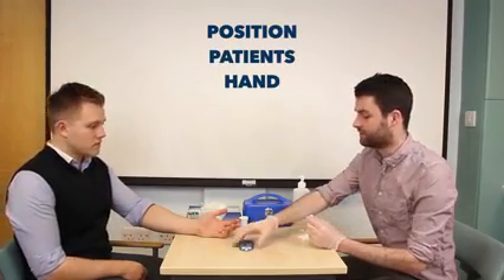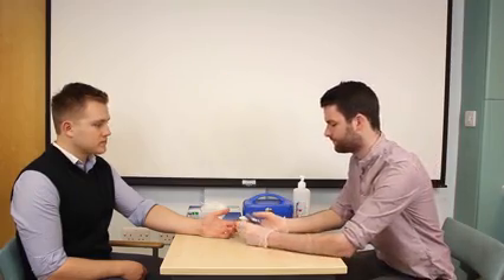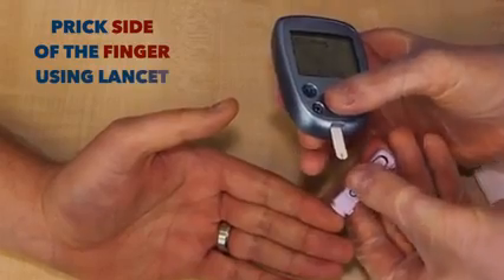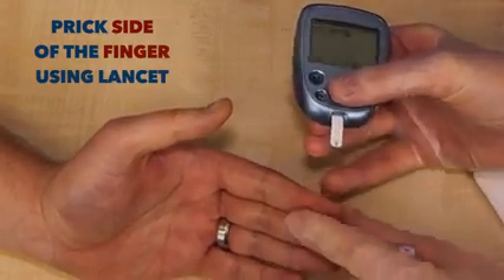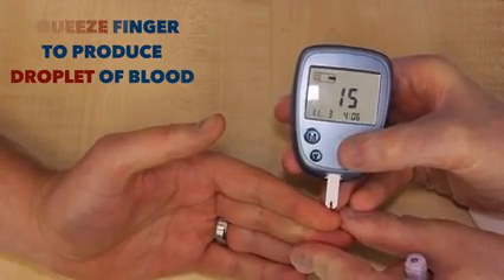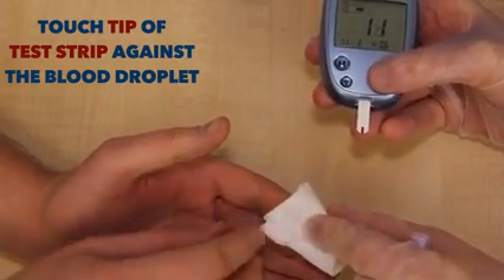If you could just put your hand on the table for me. I'm going to take the blood sample now, so you might feel a sharp scratch. Sharp scratch. Just pinch your finger together for me.